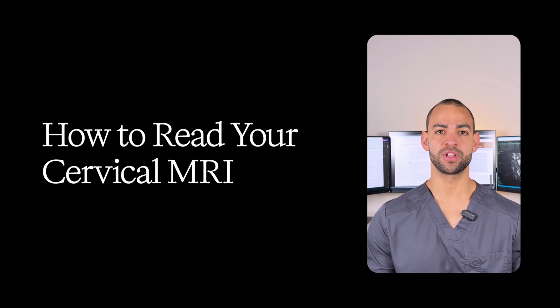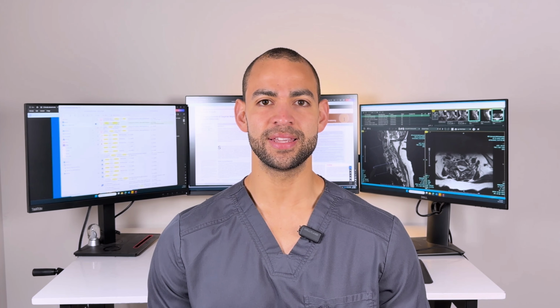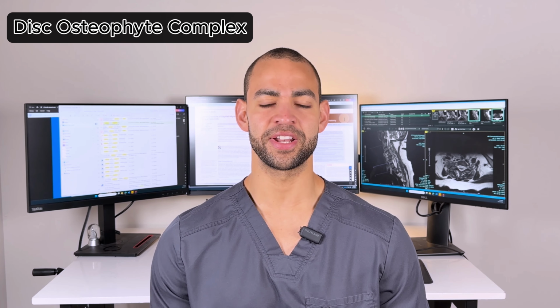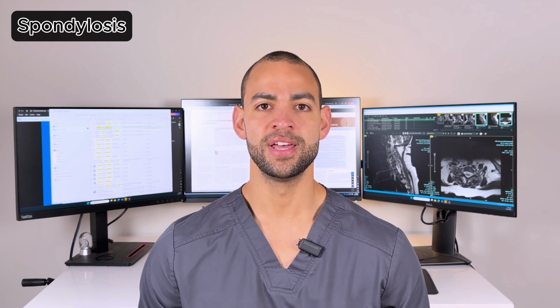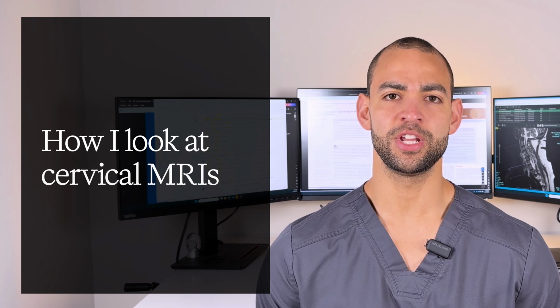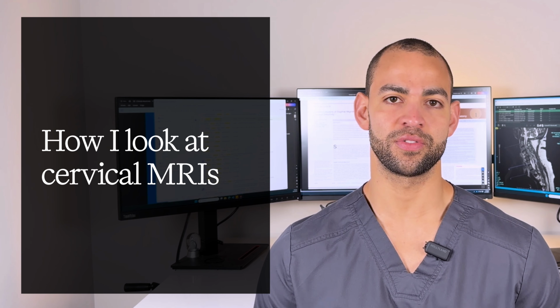You just got your cervical MRI results. The radiologist report is sitting in front of you, and it says things like disc osteophyte complex, moderate foraminal stenosis, spondylosis, and your doctor had maybe 4 minutes to explain it. In this video, I'm going to walk you through exactly what I look for when I sit down with a cervical MRI. The same evaluation I do for every patient who walks into my office.